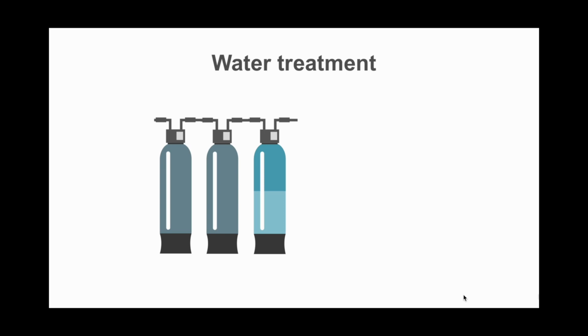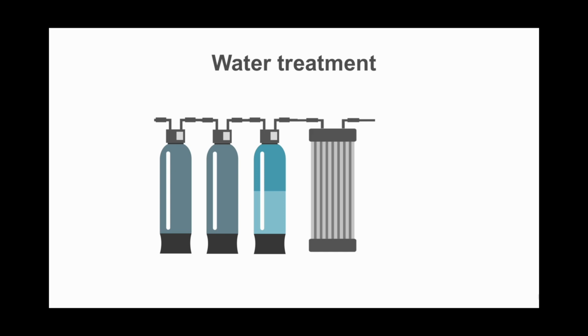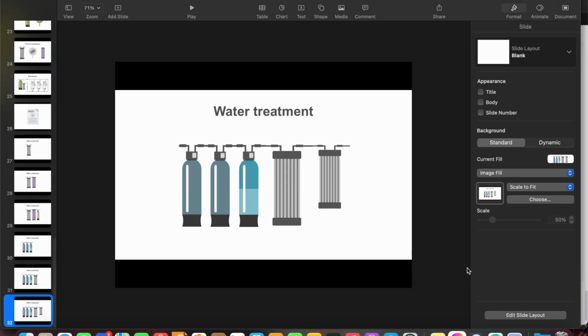There is a resin that is for softening, the sodium containing resin that removes your calcium and magnesium. Then there is the resin that removes electrolytes. Then there is a backup resin, the third one we see. Then comes a filter to remove bacteria as small as 0.2 microns. So this is how the basic RO water is delivered to the dialysis machine. This is the water purification process.